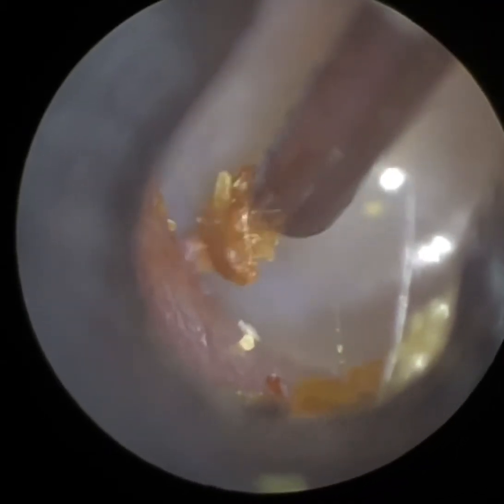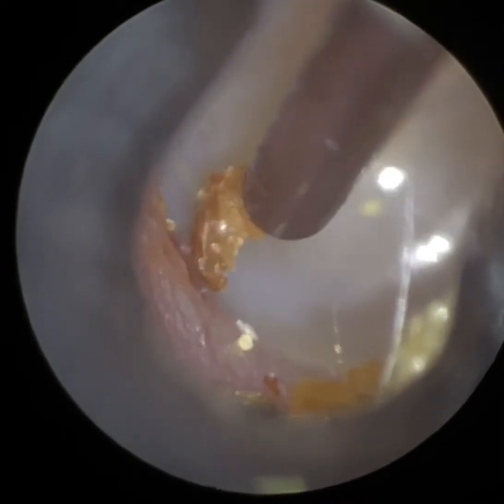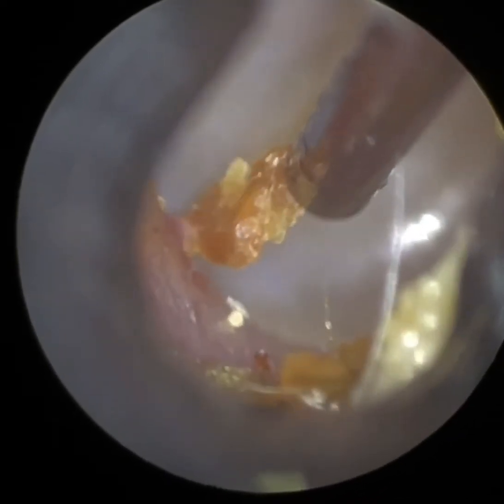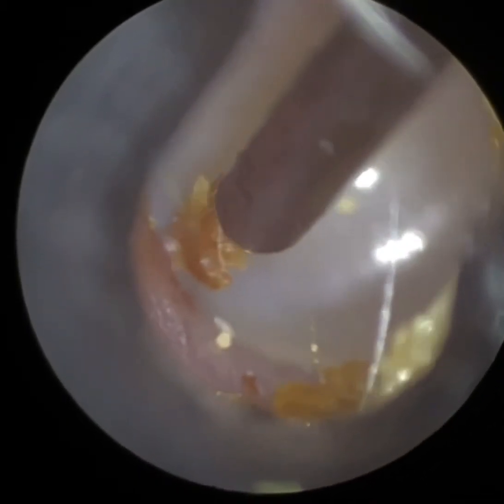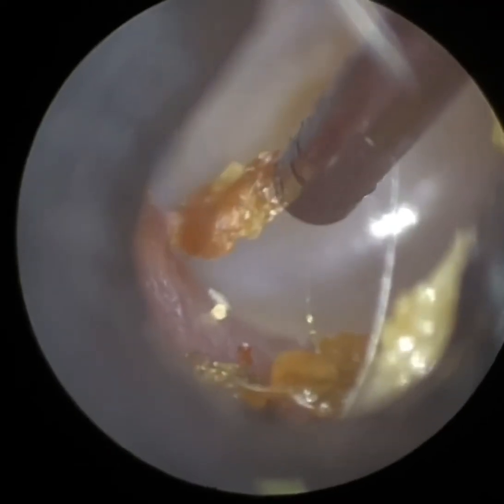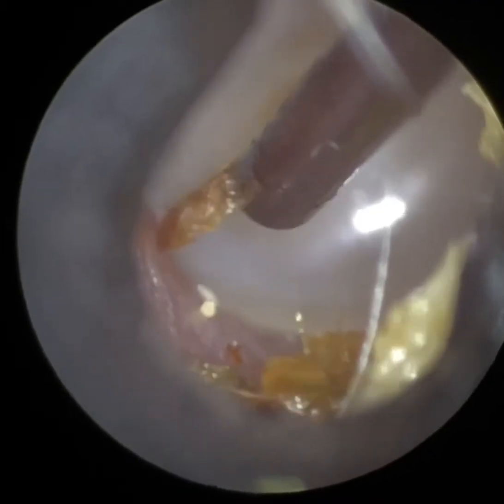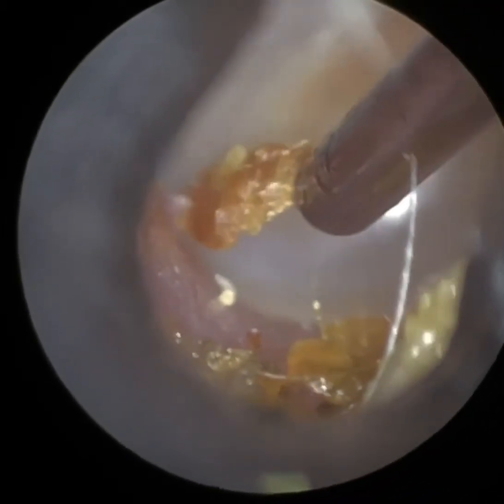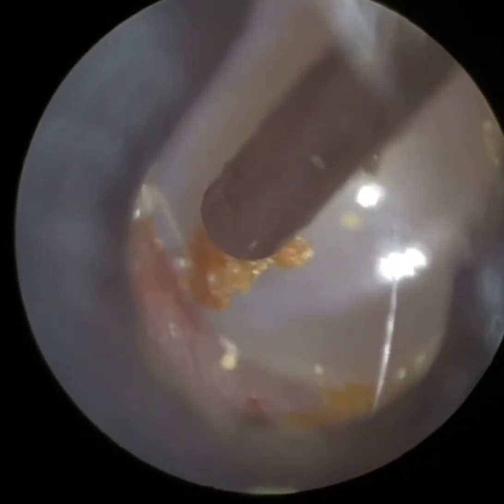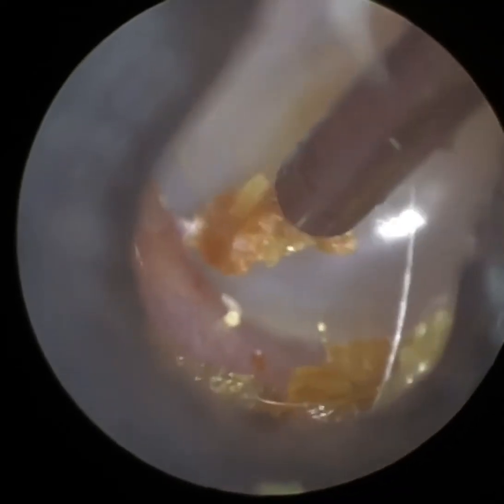Just got the fine end in focus. You can see where it's adhered. The patient did slightly find this uncomfortable — you've got a fresher layer of skin that's still attached. But in the end we did manage to remove it. You can see we're just trying to tear it away, break it apart.